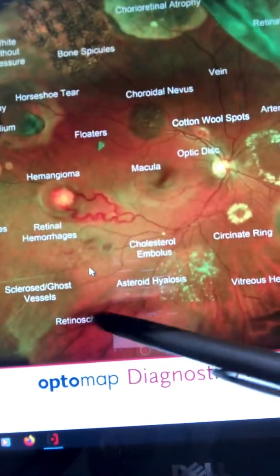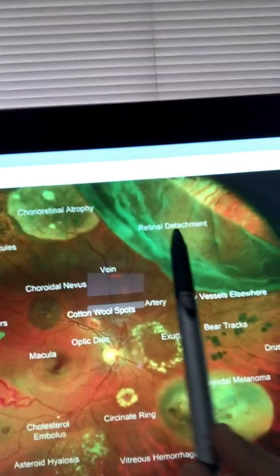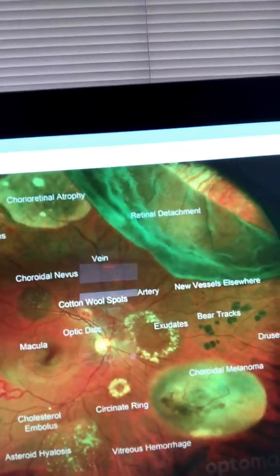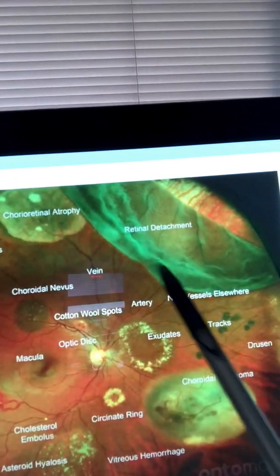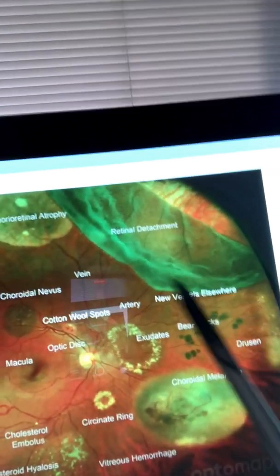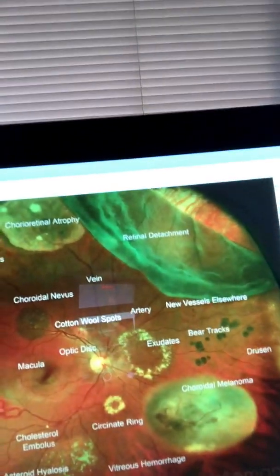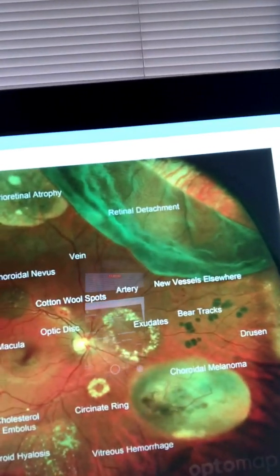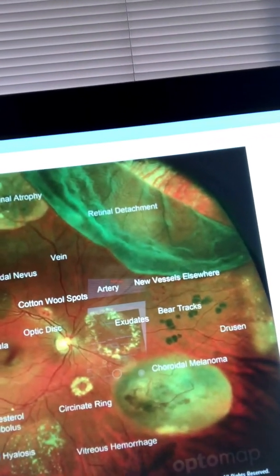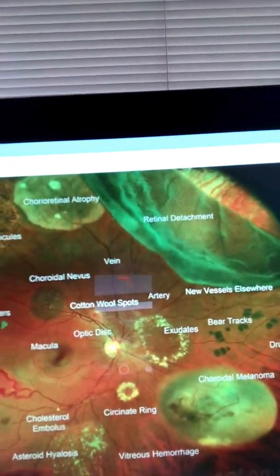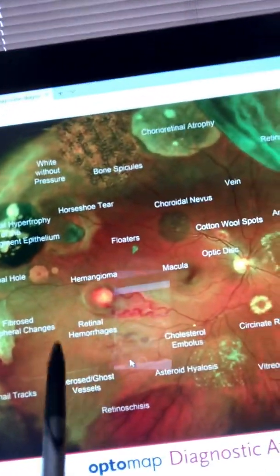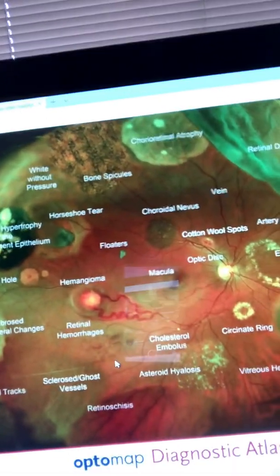Retinoschisis right here — a separation of the retina. And then the most important one, in my opinion, is the retinal detachment. You will most likely see retinal detachments in the peripheral part of the retina. This requires emergency referral to a retina specialist — you don't even wait on this one. I also don't want to miss the retinal hemorrhages right here, which are also important and require referral.